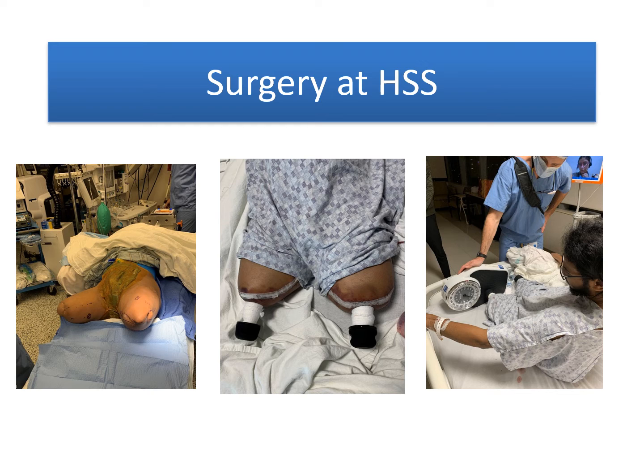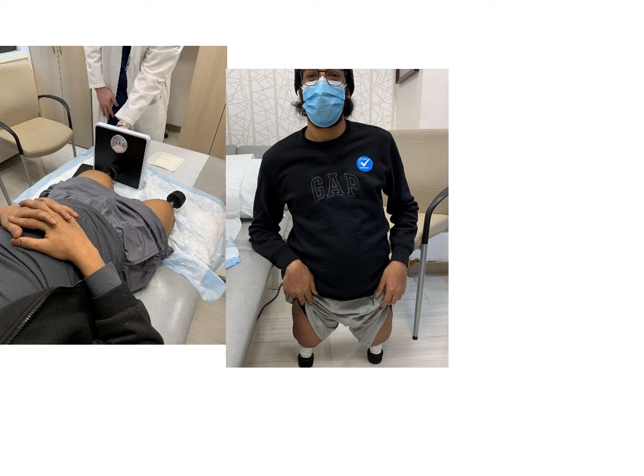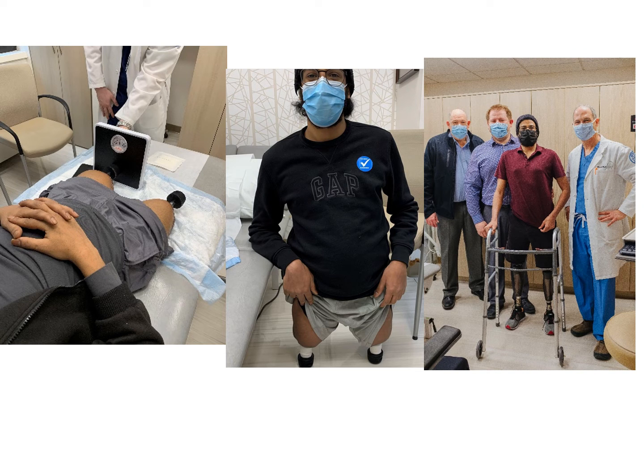This was a single-stage bilateral osseointegration limb replacement. Follow-up in the clinic shows the progressive loading that was done at first in the supine position, and then at around six weeks, I was able to allow him to start doing bilateral weight-bearing directly on the ends of the abutments.